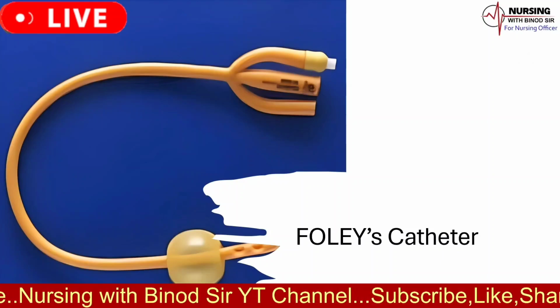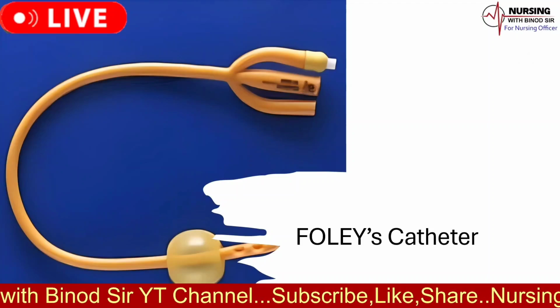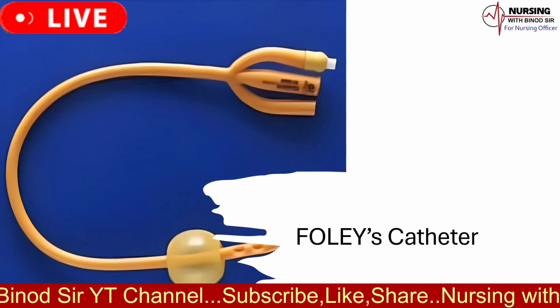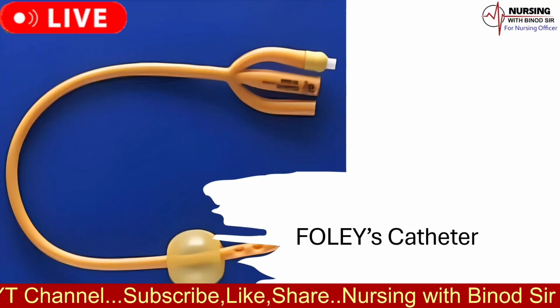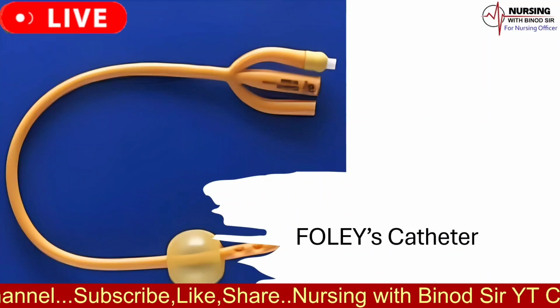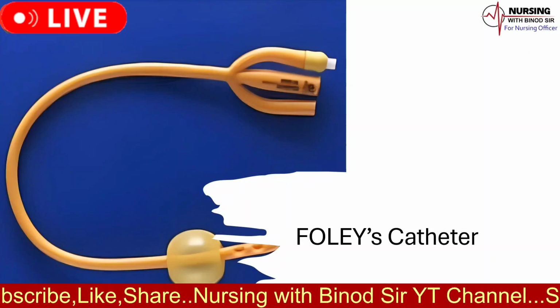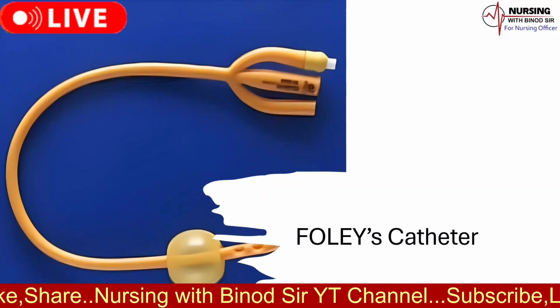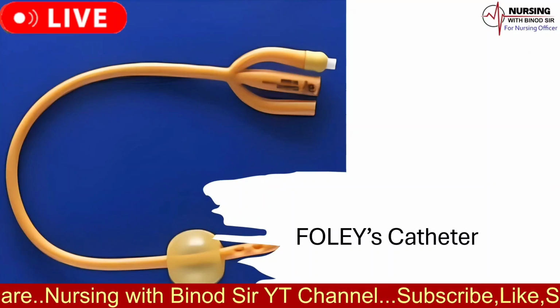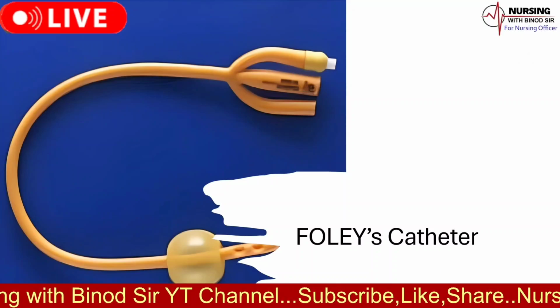4. In the management of atonic PPH, to control atonic PPH, the catheter is inserted within the uterine cavity and the catheter balloon is inflated with normal saline. The balloon provides a tamponade to the uterine surface. The catheter drains the blood from the uterine cavity if there is any.